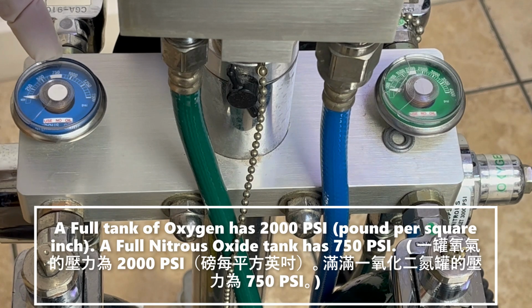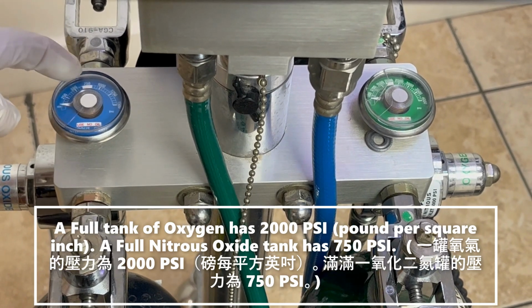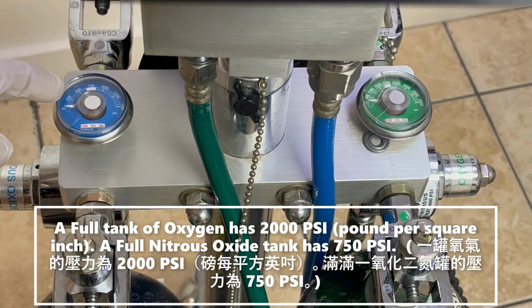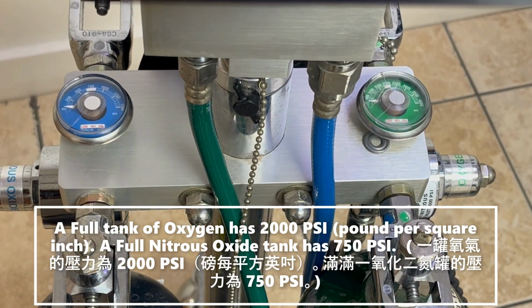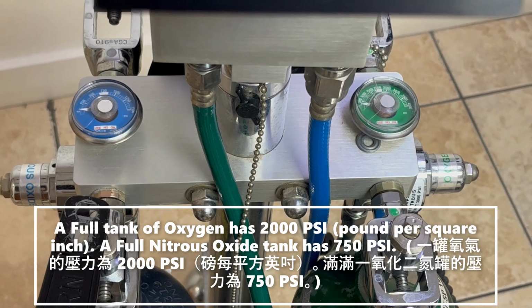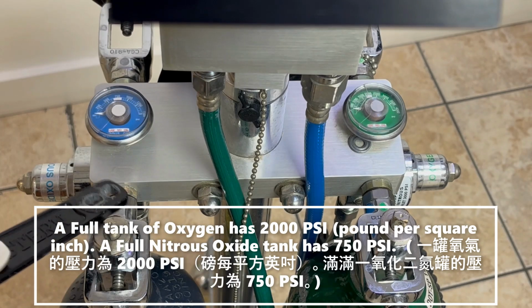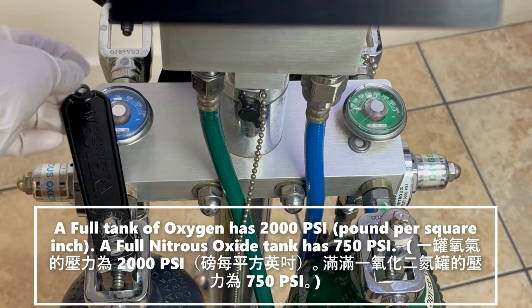As you're using the unit, the gas pressure will drop, obviously, and the needle will slowly drop on both of them. There's a key, a wrench, that you engage here and turn to turn the unit on.